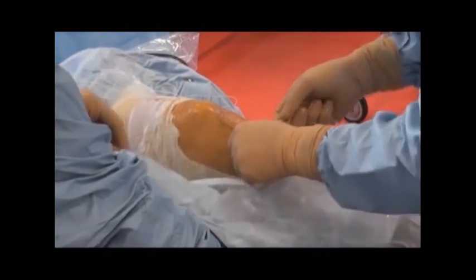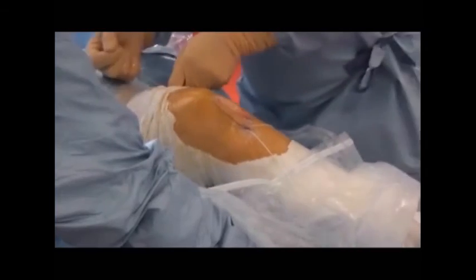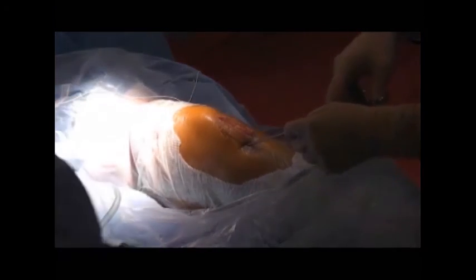Final tensioning. Fully extend the knee. Apply femoral and tibial tension to the graft by pulling on the braid sutures. Eliminate the thread ends. Use the cutting pliers to cut off the white threads.